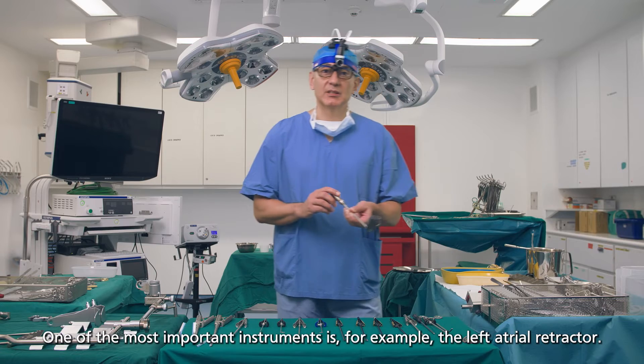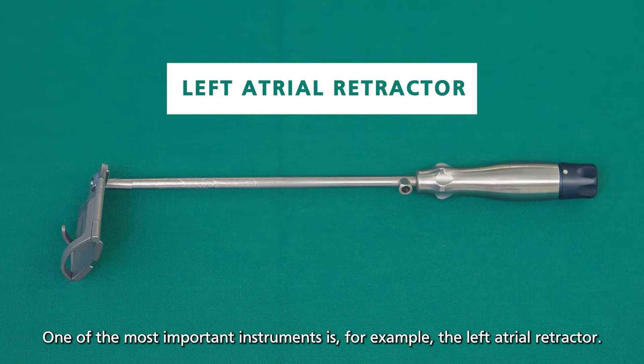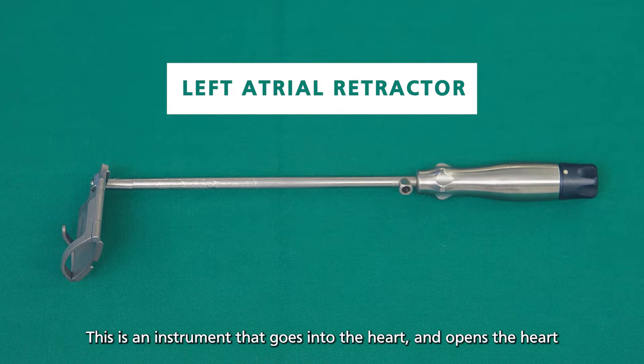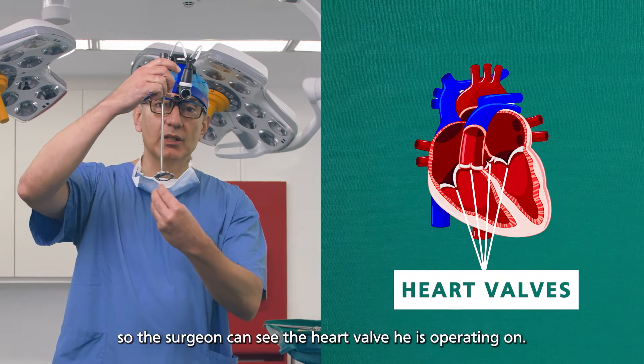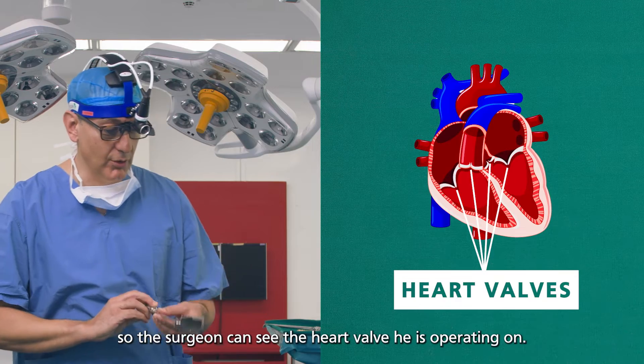One of the most important instruments is, for example, the left atrial retractor. This is an instrument that goes into the heart, opens the heart, so the surgeon can see the heart valve he is operating on.